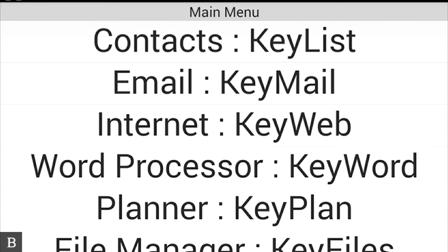One of the biggest benefits of the BrailleNote Touch is the Keysoft interface and the way HumanWare has customized this device. It's so much more than a note-taker — it's a Braille tablet. What's wonderful about it is that you don't have to know anything about Android to use this device effectively. Things like first letter navigation and familiar Braille shortcuts make it a very simple device to use. The options menu is a bridge between Android and Keysoft, letting you configure speech and Braille and also access Android settings.